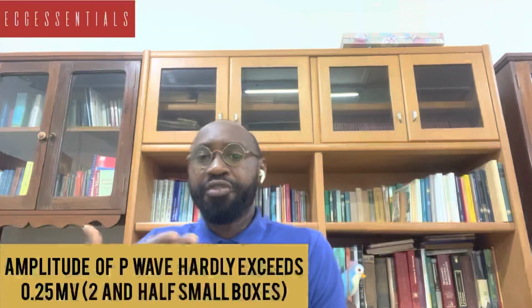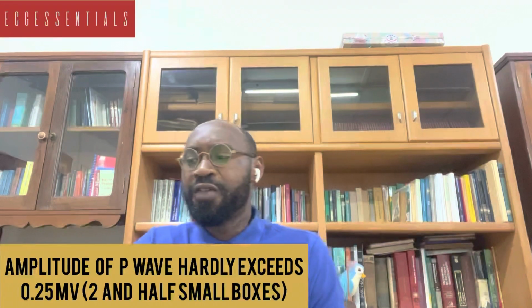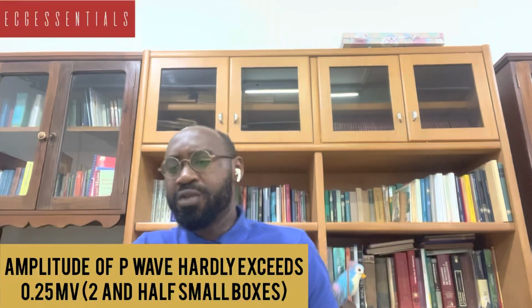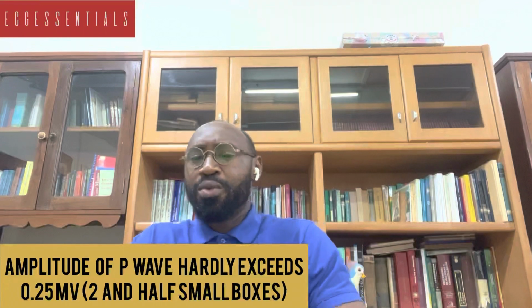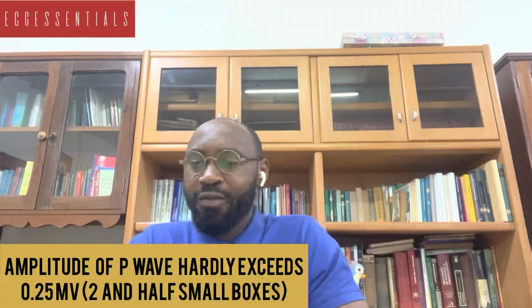And apart from how the waveform may look, overall the atria are known to be small, and so the voltage generated from the depolarization of the atria is not expected to be too huge. So the amplitude of the P wave that represents atrial depolarization normally may not exceed 0.25 millivolts in any lead at all, because the atria are too small to generate any substantial voltage.